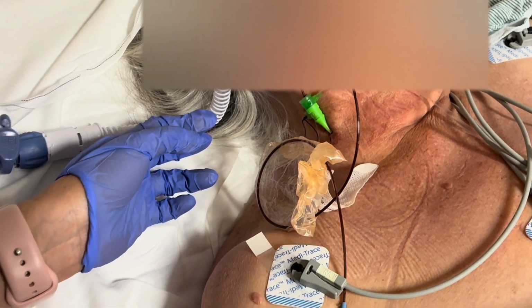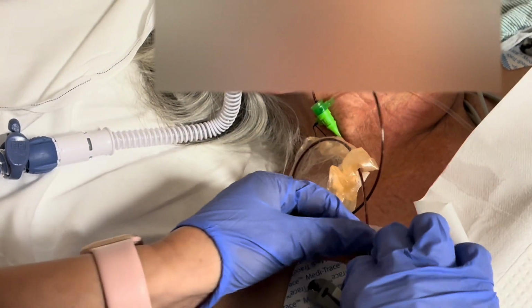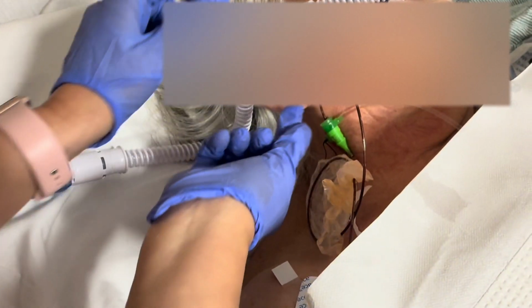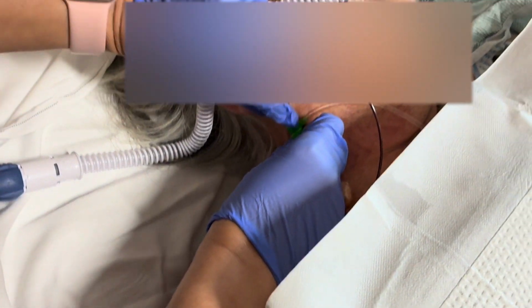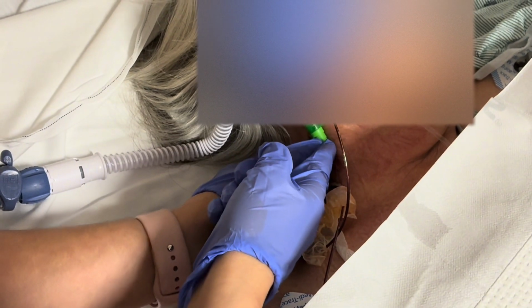So what we're gonna do is we're gonna take out the EKOS catheter first. So Asha, what we do, we just pull very slowly. So you wanna pull it, Miss Asha, this one here. So when I pull, I hold this and then just pull this very slowly. So this catheter is actually sitting where the clot is on the left main, okay?